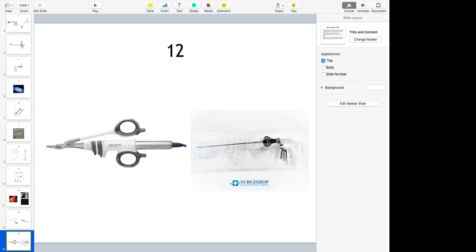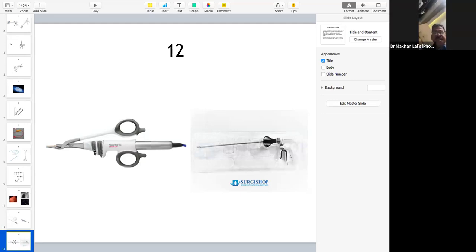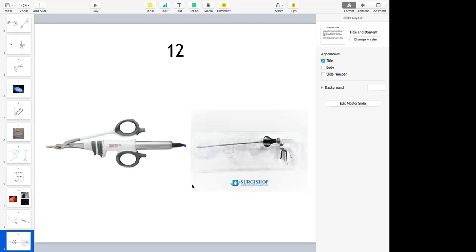You activate. So what does minimum and maximum signify, either on the foot pedal, if you're using the foot pedal, or on the hand switches? It is shown as a 3 and 5 usually. Minimum will coagulate, and maximum will cut. Maximum will cut.